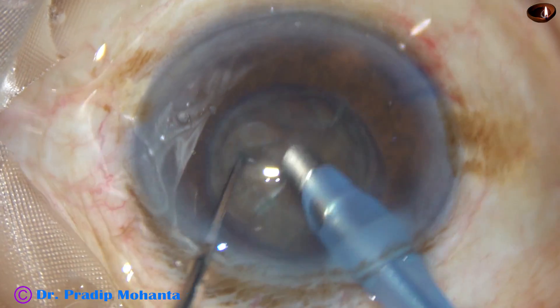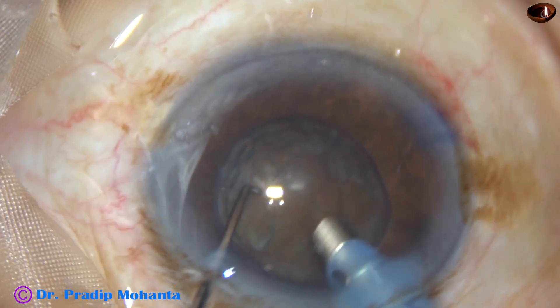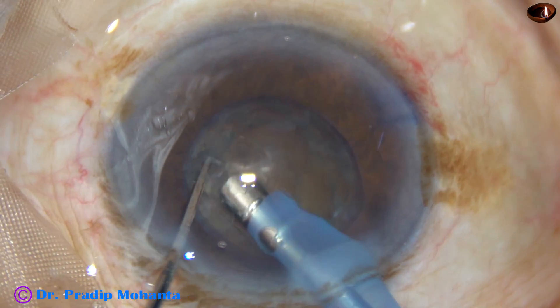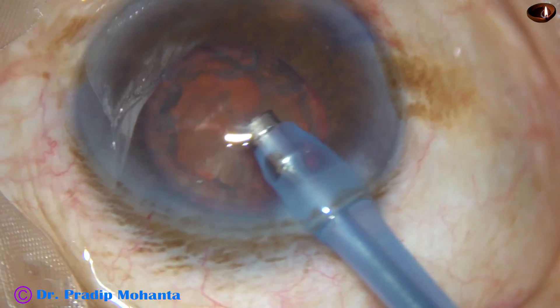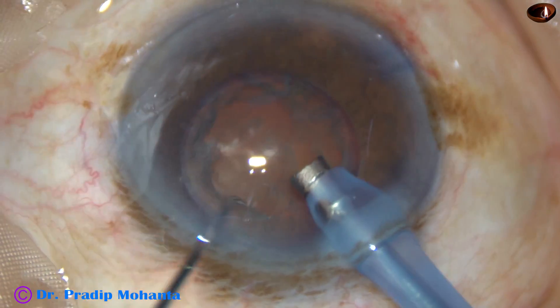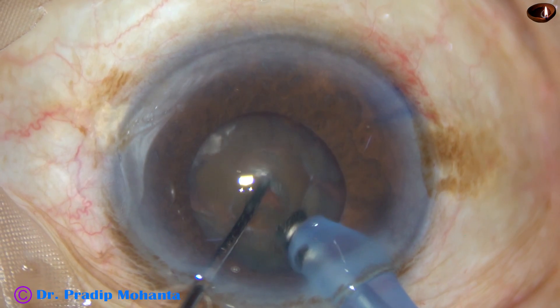Now with very low vacuum and moderate flow rate I have started the phacoemulsification. I am in FACO2 mode from the very beginning and I am going to divide the nucleus by my technique which I call the submarine chop.